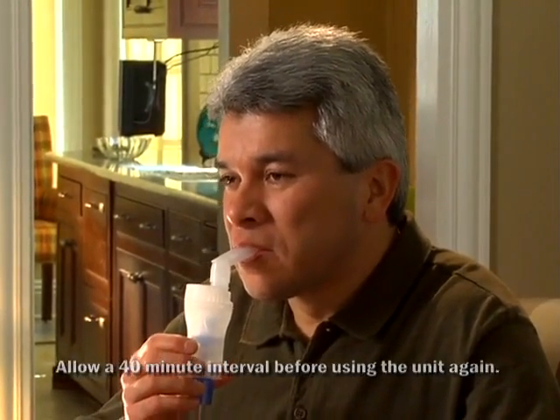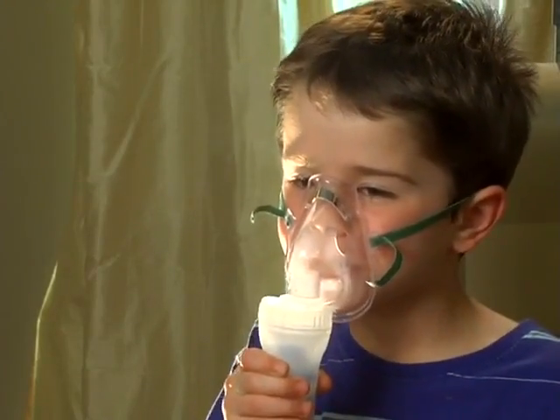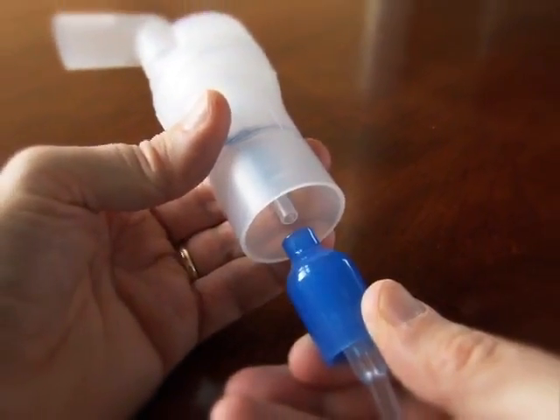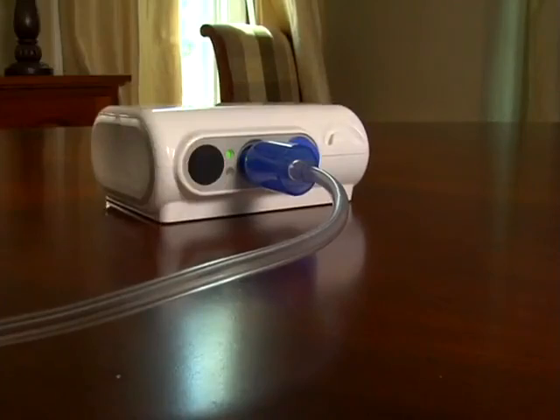If you are providing a nebulizer treatment to a child, attach the mask so it covers the child's nose and mouth. The child should breathe in and out normally through the mask. When you have completed your treatment, turn the compressor off. Unplug the air tube from the nebulizer kit. If there is any moisture or liquid in the air tube, turn the compressor on and pump air through the air tube to remove the moisture.